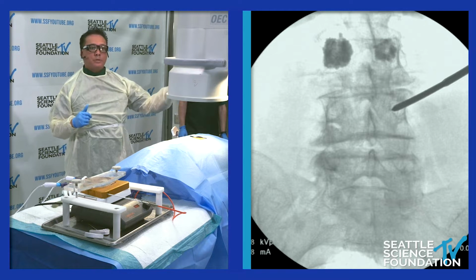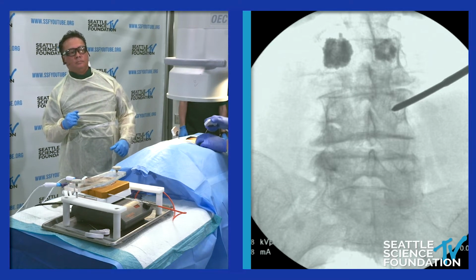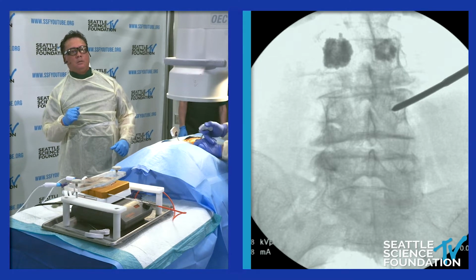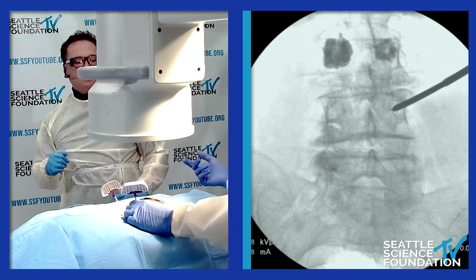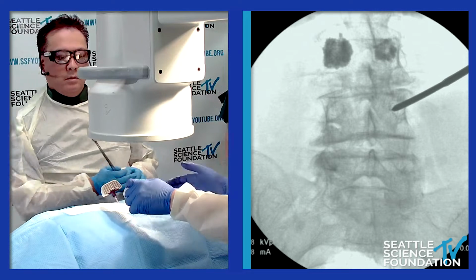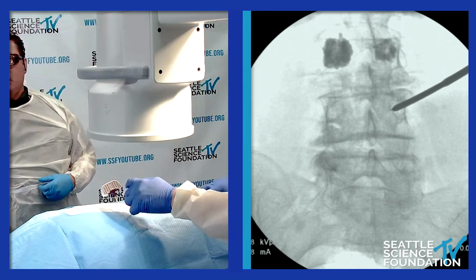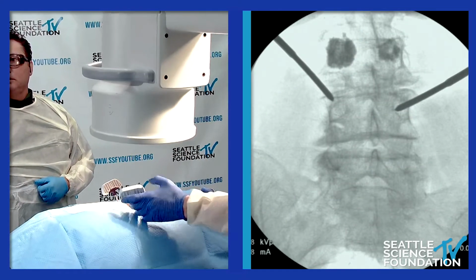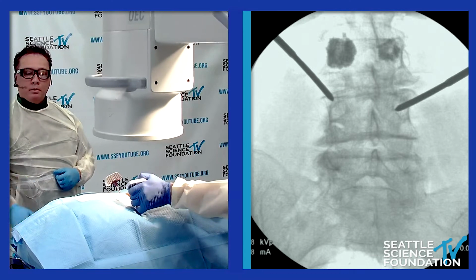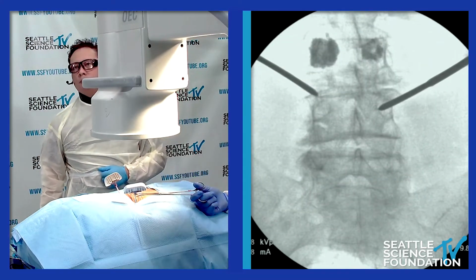You can start accessing the other side though. Yeah, I mean, I think the key is that when you reach the medial wall of the pedicle on an AP view, you want to be at the back wall of the vertebra. That's the danger zone. So that's guaranteed that you are through the pedicle all the way down to the vertebral body, as long as you check it on the lateral. Glenn likes to work in the danger zone, I think. Yeah, well, I'm staying at that medial line of the pedicle there. Let's take a shot.